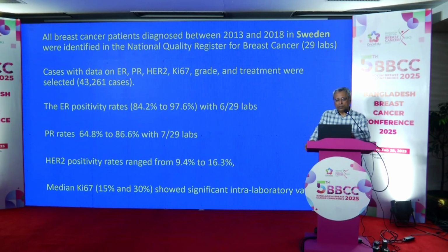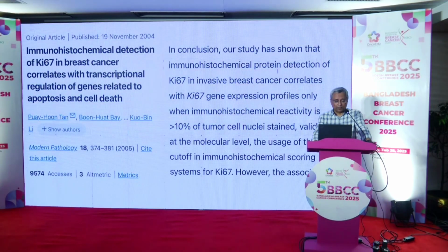I don't know, there might be some data here in Bangladesh, but I haven't come across any this sort of studies done here. If there's anyone who knows, please correct me if I'm wrong. So I think it's essential that at least one lab, like the premier lab, should do this auditing of ER, PR, and HER2. And it will give you a small project and a publication also.